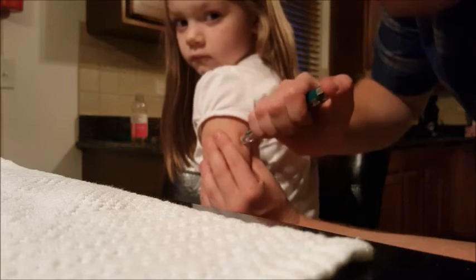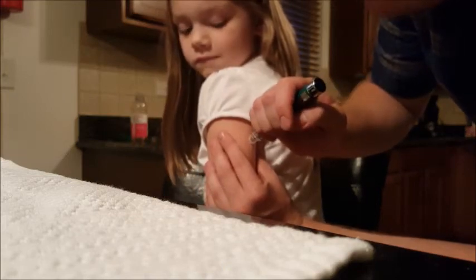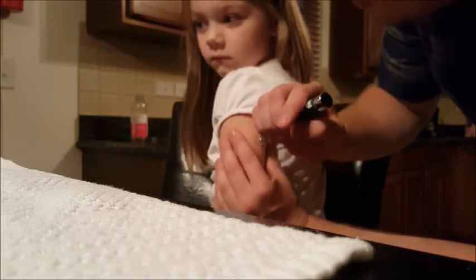When you have the pen all set, take the back of her upper arm and you pinch it a bit. Put the needle in. Push down on the top all the way down until it won't go down anymore. Hold it in for five seconds. Then you take it out.